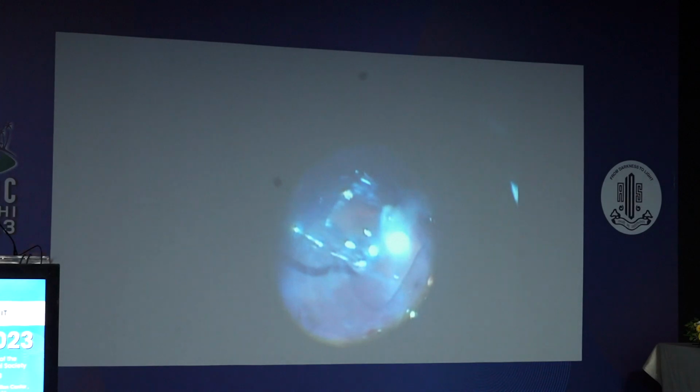So why was there no PVD on the table? It was not there. That's one more reason why probably there is no PVR, nothing. So some posterior hyaloid is holding on. Somewhere, some tiny break is holding on, probably not easy to find, and intermittently fluid is seeping through. But during primary surgery, obviously, you are not sure, so you could not seal that break. It probably still remained open. So again, going back, fluid slowly seeping.